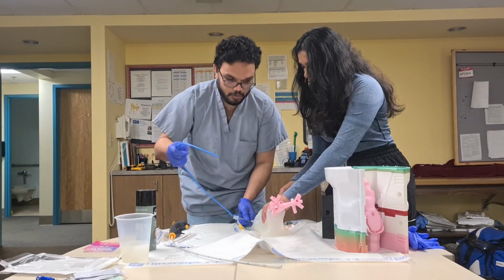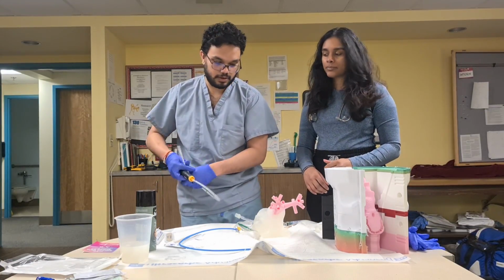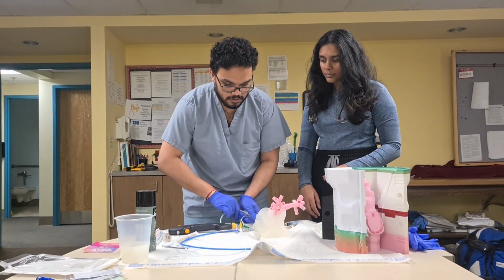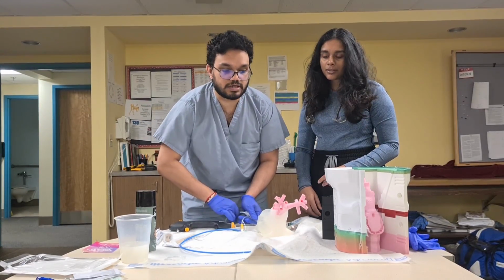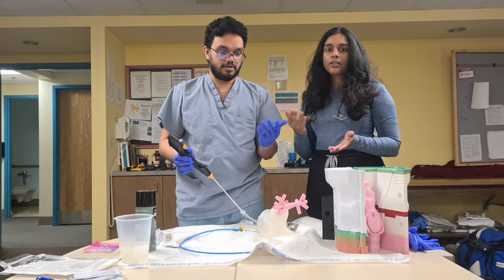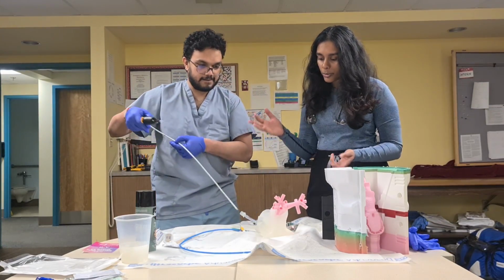24, and now obviously we don't have lungs to see whether we're in the airway or not, but I could see it. But the best test is just to pass the bronchoscope through, and you can hear the sound that it's in. Obviously we don't have a camera to see where we're going, but it's in, and that demonstrates the proof of concept.